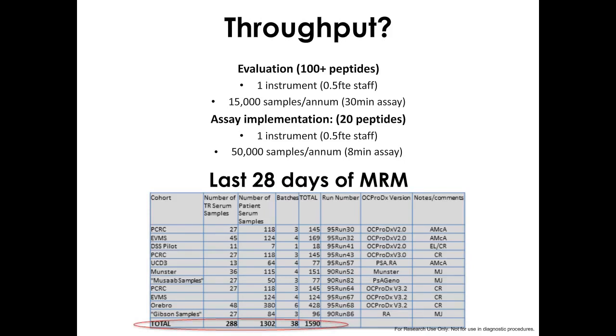And so that demonstrates, I think, that for one instrument, we could implement this assay for all of the prostate cancer patients in Ireland. It gives a sense of the scale and the realization that the throughput of a mass spectrometer, depending on the assay and the clinical need of that assay, means that it could reliably be used to measure and assess prostate cancer patients in this case.